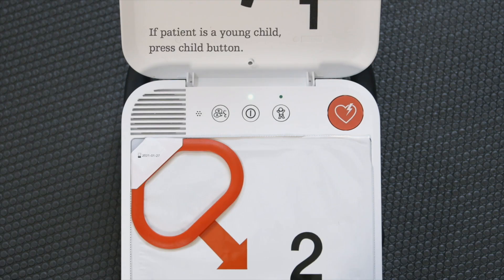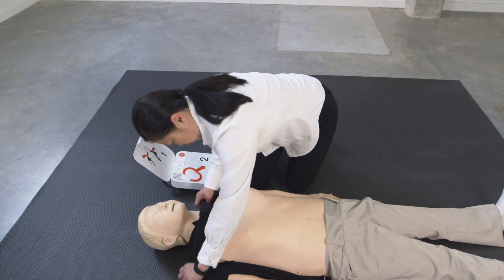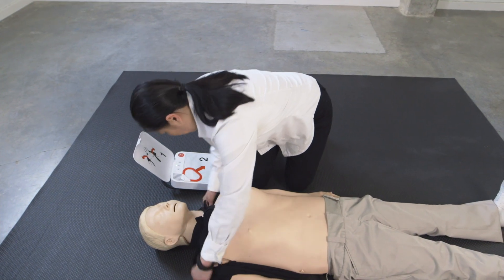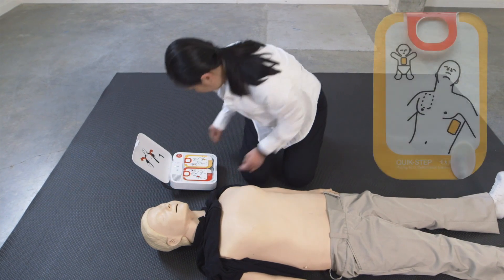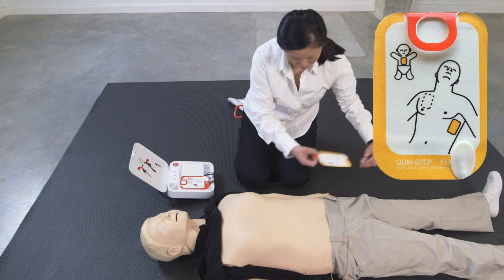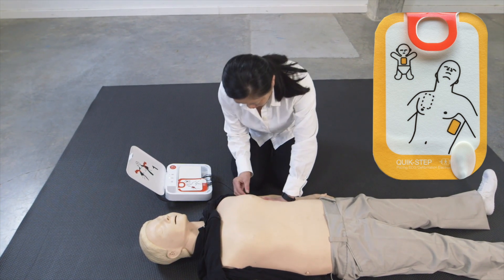Adult Mode. Remove all clothing from patient's chest. Pull red handle to reveal pads. Look at pictures on pads. Apply pads to bare skin exactly as shown in the pictures. Press pads firmly.